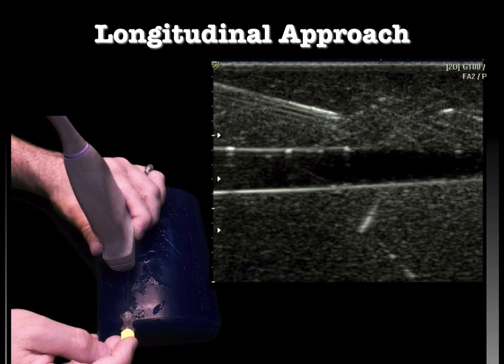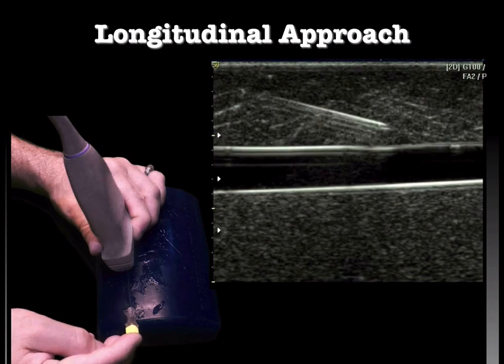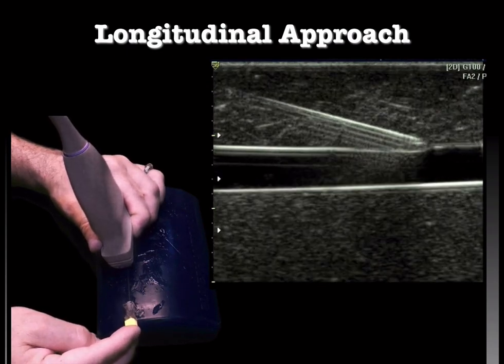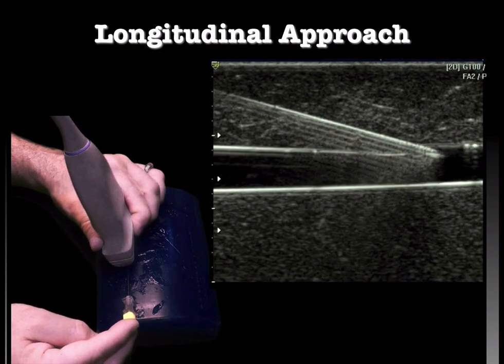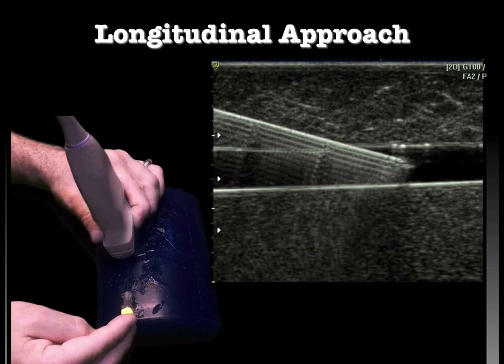Here we have our vein, and as you notice, when the vein is getting a little out of plane, the vein wall starts getting dull, as it is here. The needle will also get dull when it goes out of plane. And so the challenge here is to know which side of the vein the needle's on and then to line them all up. So conceptually, this is a little bit more difficult than that cross-section or short axis approach.